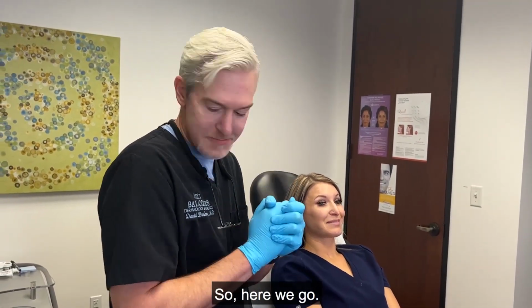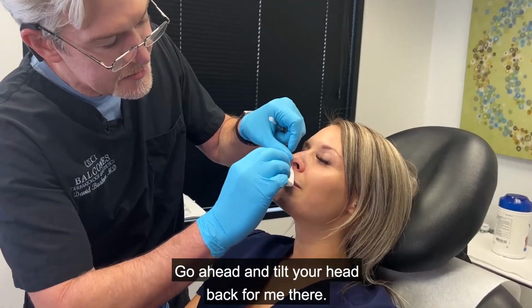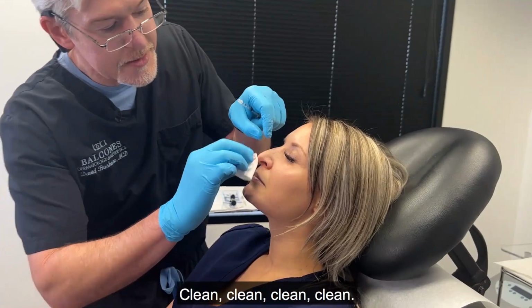So here we go. So now I'm going to clean first, make sure we're really good and clean. Go ahead and tilt your head back for me there. Good. Clean, clean, clean.